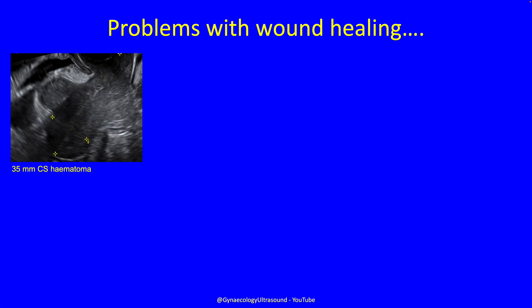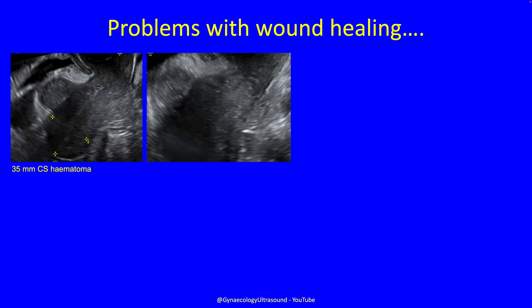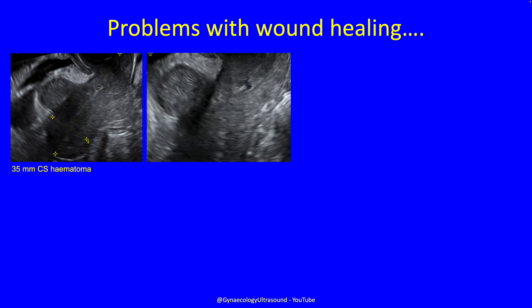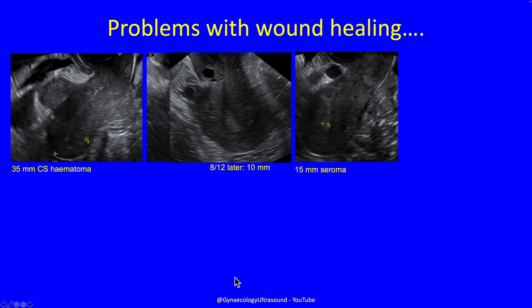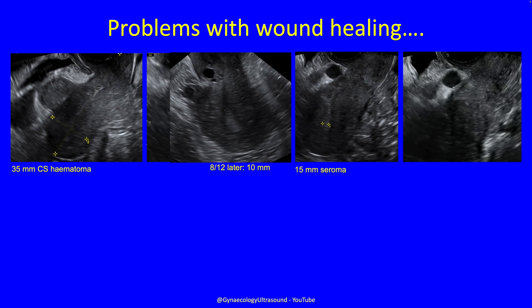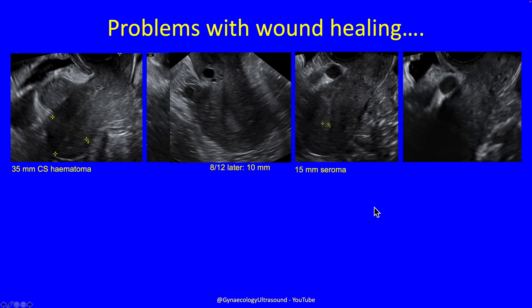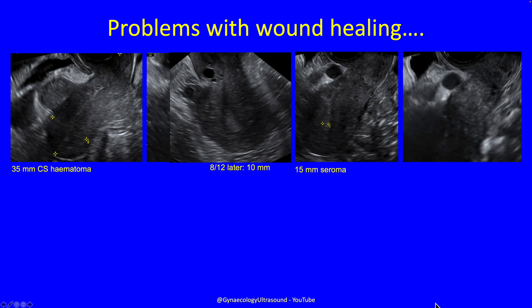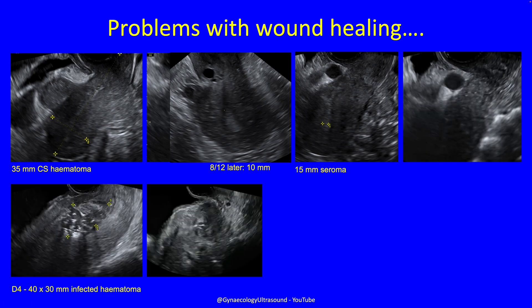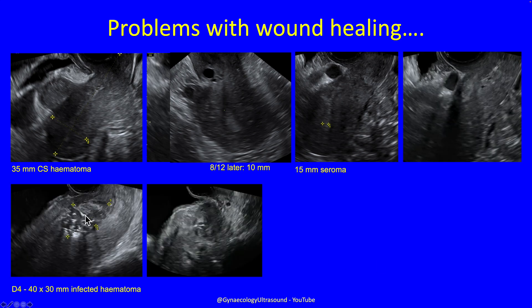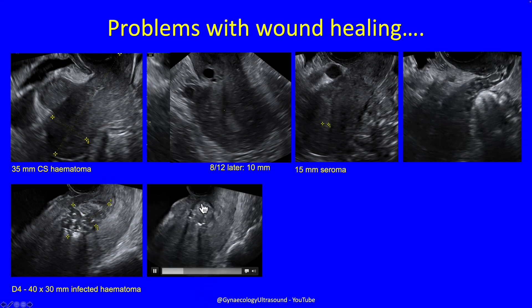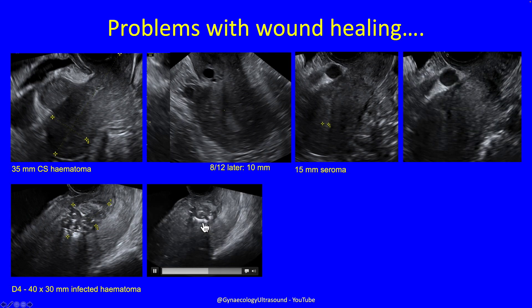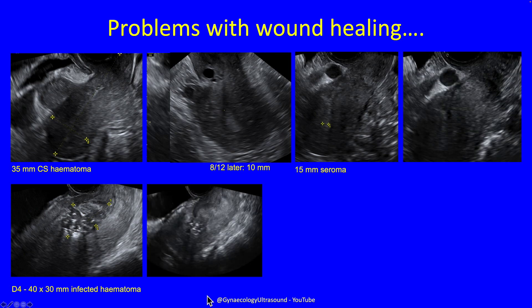Sometimes you get problems with wound healing. This patient had a 35 mm caesarean section hematoma, and sometimes these heal as fibrous tissue — in this case it became very small. This patient ended up with a small seroma at the site of her section scar. This patient had an infected hematoma: you can see air and suture material, clearly at the site of the caesarean section, with brightly echogenic air — so there's an abscess.